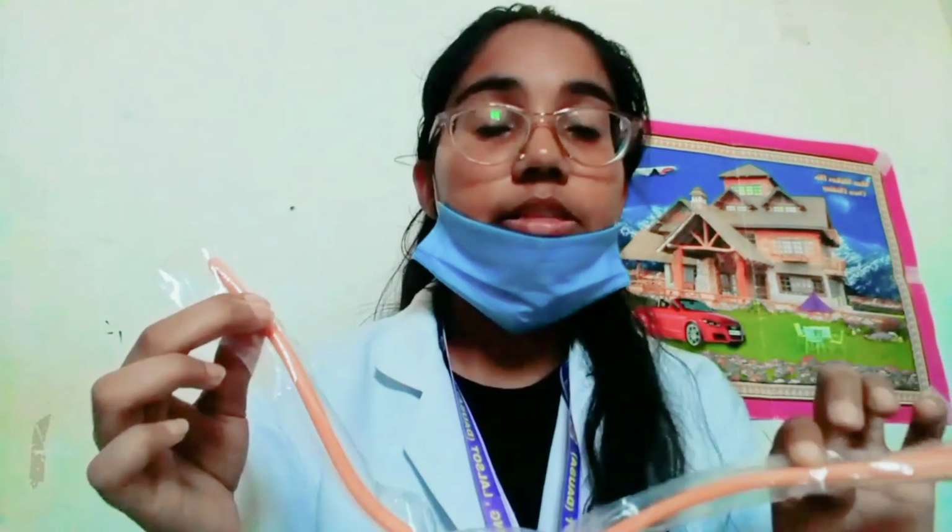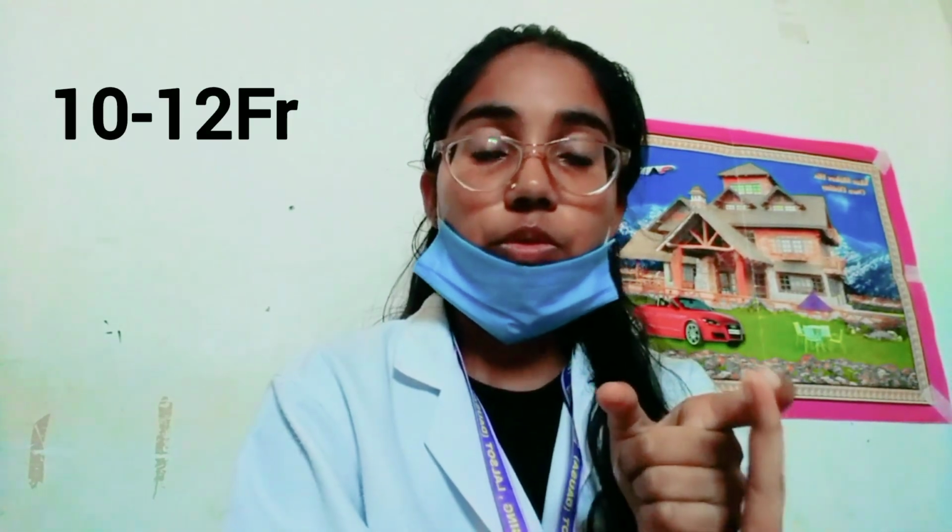In adult male and female patients, the catheter size is 12 to 18 FR, French catheter, and in children there are also subcategories. In infants, 5 to 6 French catheter is used. In toddlers, 6 to 8 French catheter is used. In preschool children, 8 to 10 French catheter is used, and in school-going children, 10 to 12 French catheter is used.